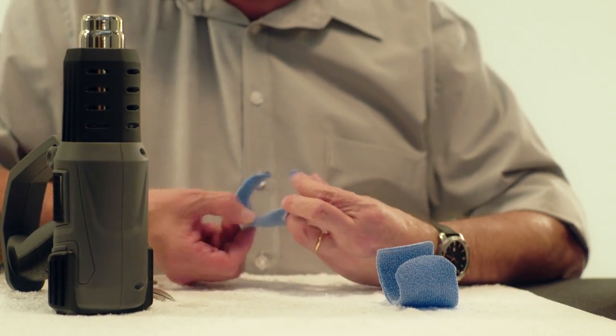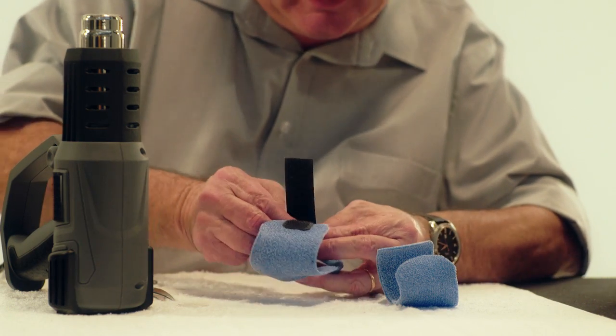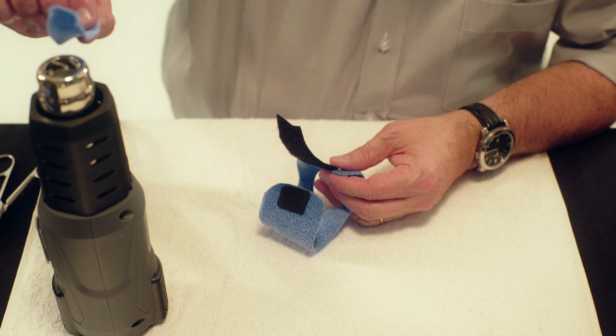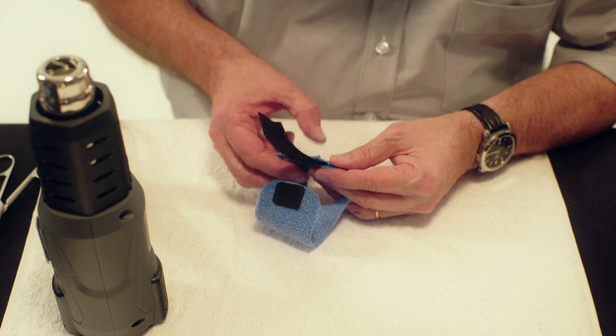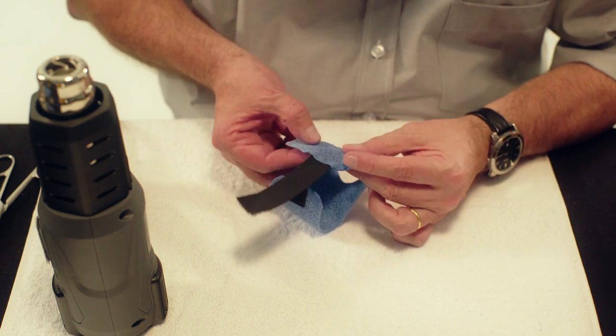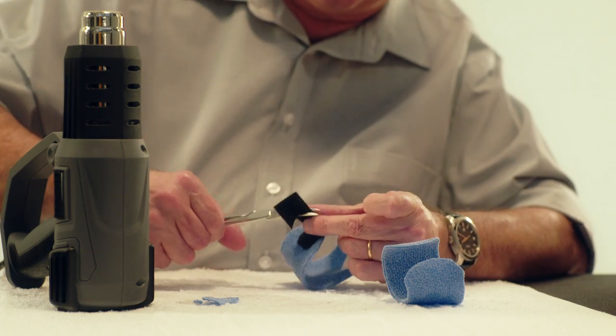Heat the other side with a heat gun and stick a piece of velcro loop with the fuzzy side down onto the orthosis. Secure the velcro loop by heating a small piece of Orphicast with the heat gun and stick it over the edges of the velcro loop. Do the same with the other part of the orthosis.